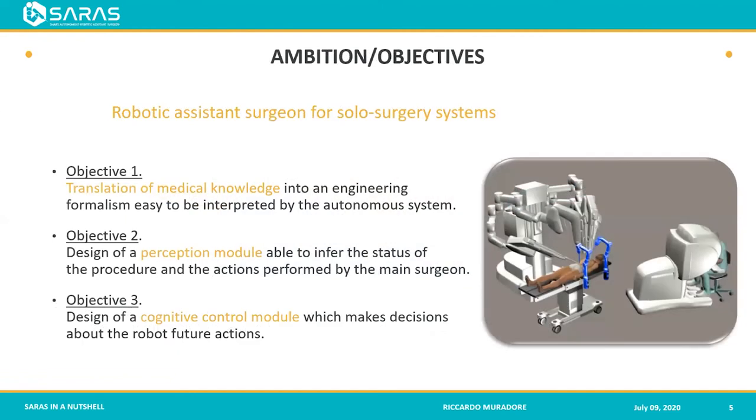So in order to reach this goal, the solo surgery system, we need to meet three main objectives. The first one is the translation of the medical knowledge into an engineering formalism easy to be interpreted by the autonomous system. Medical knowledge is quite complicated to engineerize, so this is not at all a trivial task.